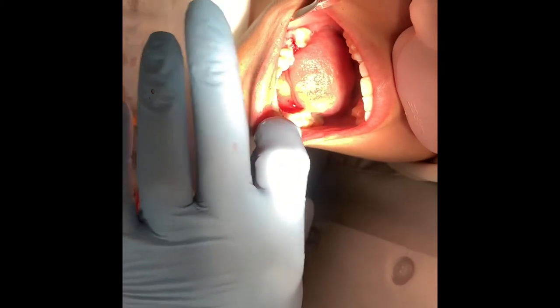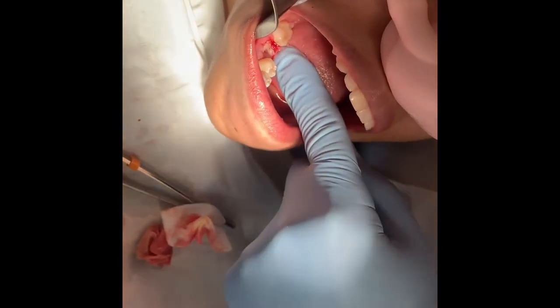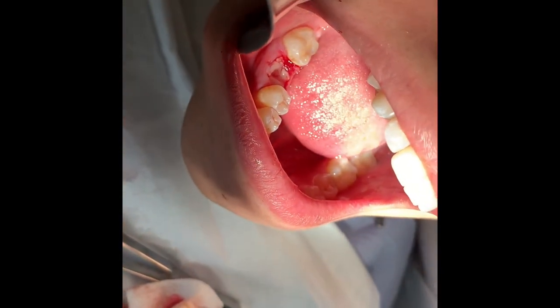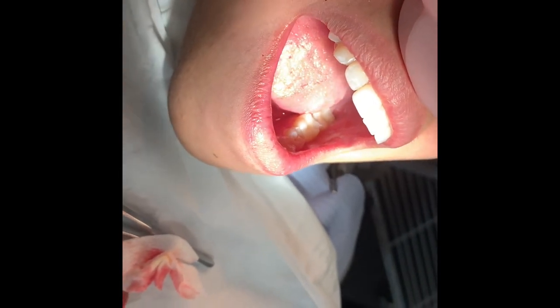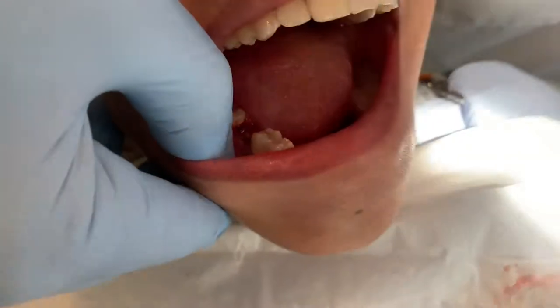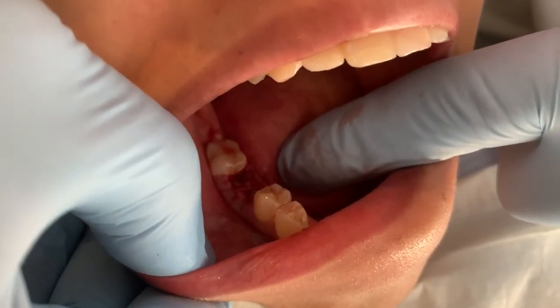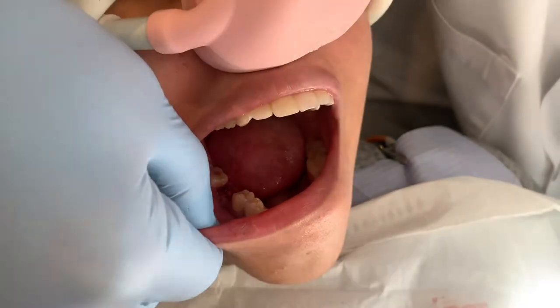Go ahead. Okay, this is what the site looks like once we have the platelet-rich fibrin in there. You can see the site's totally filled with the fibrin. And all we have left to do at this point is apply a couple stitches. I'll show you that in a moment. So that's what the extraction site looks like with the platelet-rich fibrin in there. Basically, you can see how the sutures are wrapped around the site. And really all it does is keep the gum tissue still and hold the platelets in there.